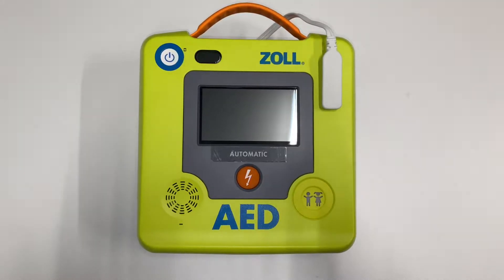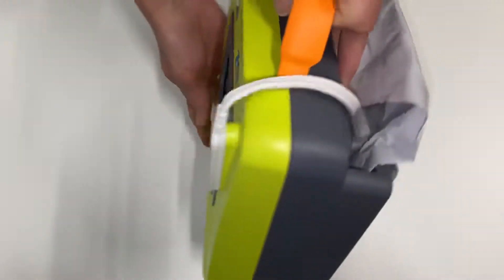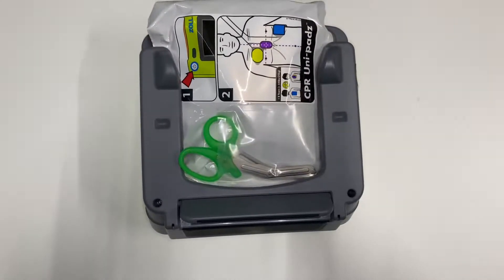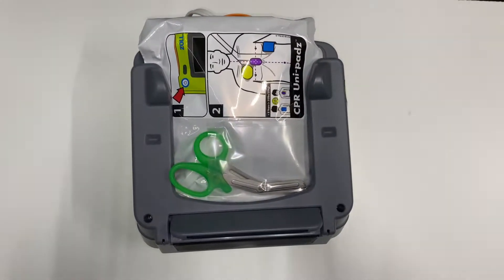Turn your defibrillator over. There is a pad packet on the back — go ahead and remove the pad packet.